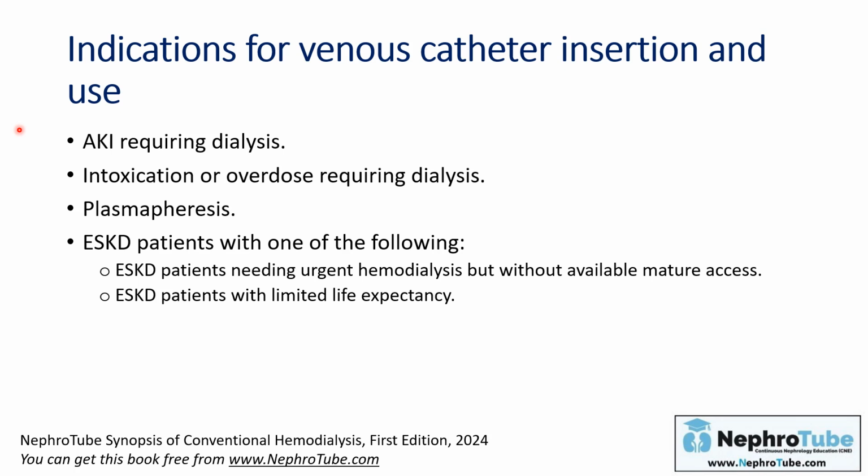As we mentioned, the concept of fistula first is not the one used now. We are now using what is called patient first. So there may be an indication for the use of venous catheter in patients with end-stage kidney disease, especially those with limited life expectancy. You can refer back to the previous lectures about AV access to check which access is indicated in which patient.